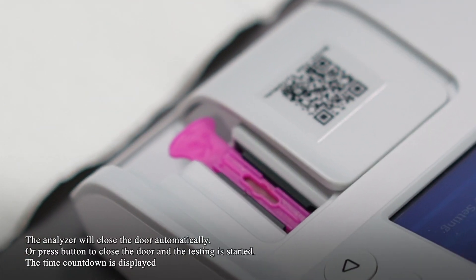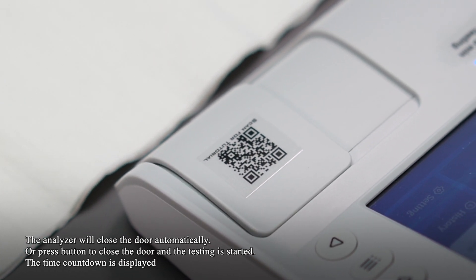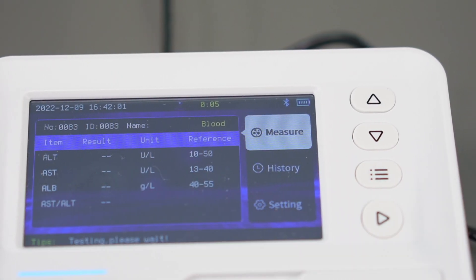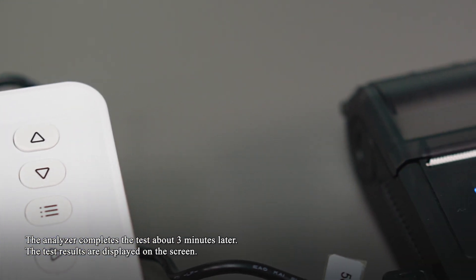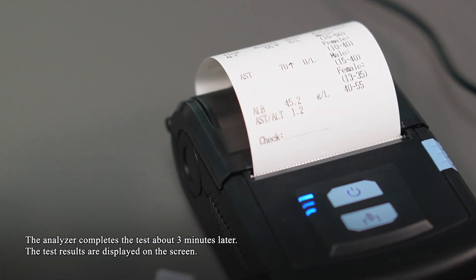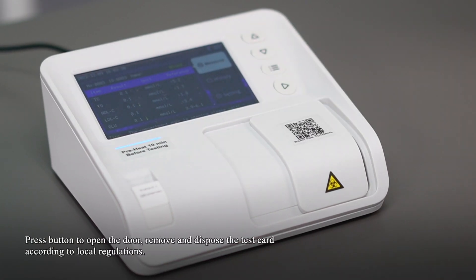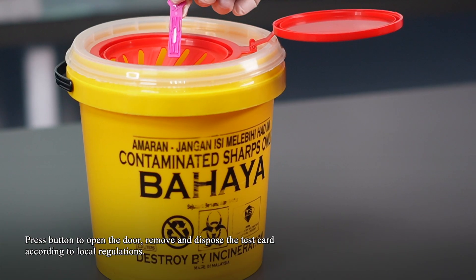The analyzer will close the door automatically, or press the button to close the door and start the test. A time countdown is displayed. The analyzer completes the test in about three minutes. The test results are displayed on the screen. Press the button to open the door, then remove and dispose of the test card according to local regulations.